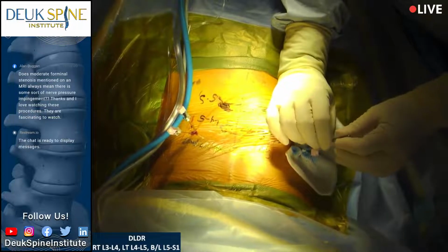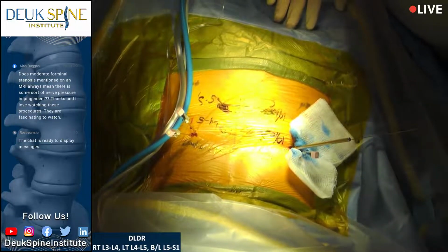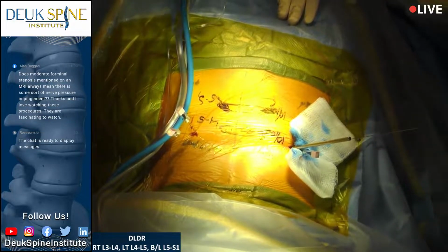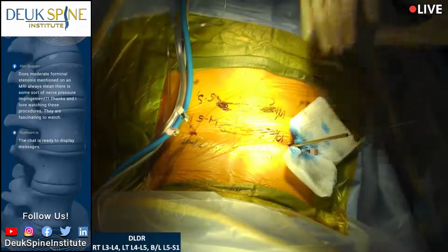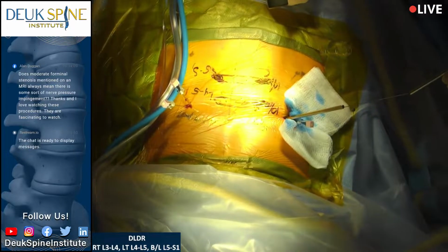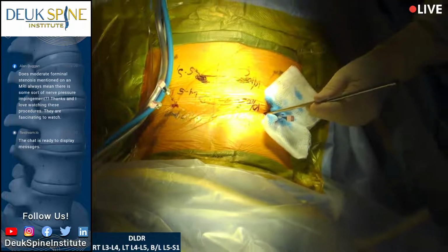You can actually see the herniation there, just in front of the dilator. Shot. Yep, so the dilator, literally the tip is kissing the herniation. You can see the bulge back right there. That's what the dye is around. Lay still, you're doing really good. This will be fixed before you know it, and you'll be going home. So she's here with her family. Shot.